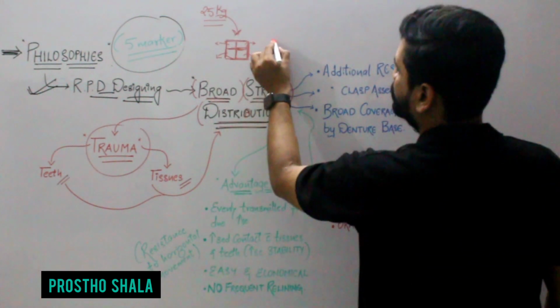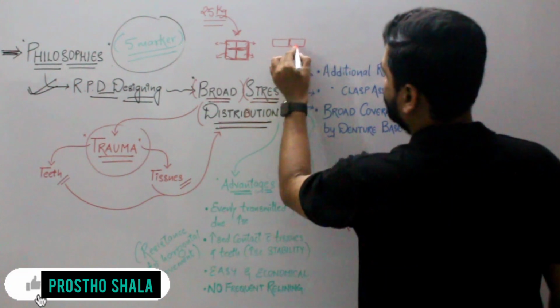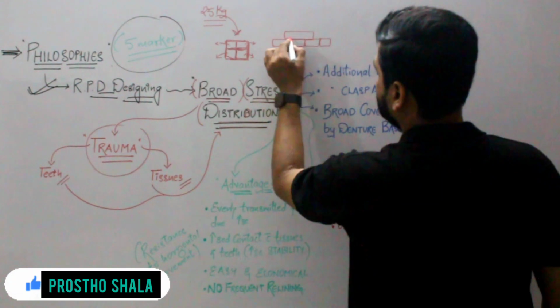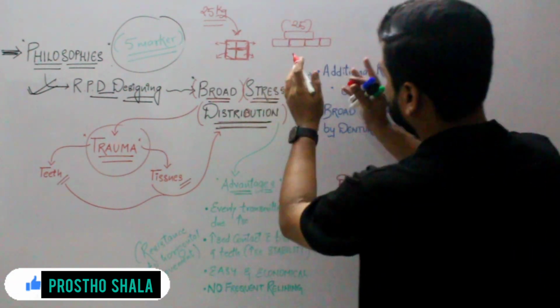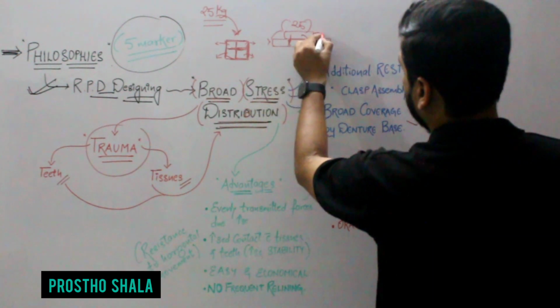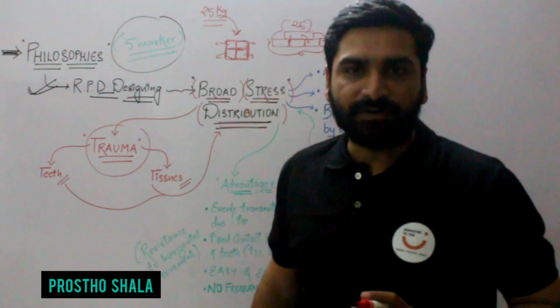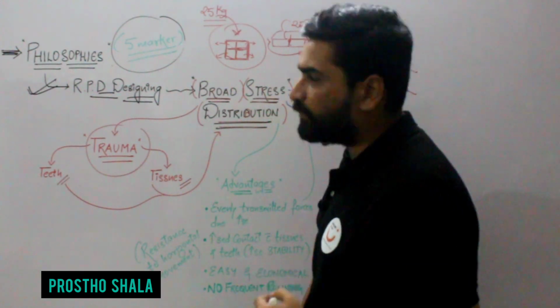Similarly, if I keep the 4 small boxes in one line and then place that 25 kg of weight, the stress is distributed broadly into all the areas, so these four boxes cumulatively can take up the load of 25 kgs, whereas in the previous situation it was not possible.